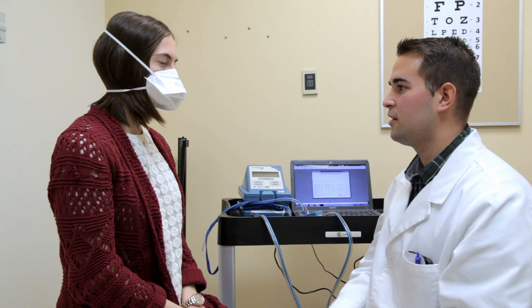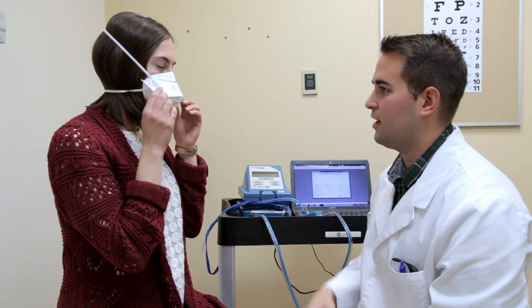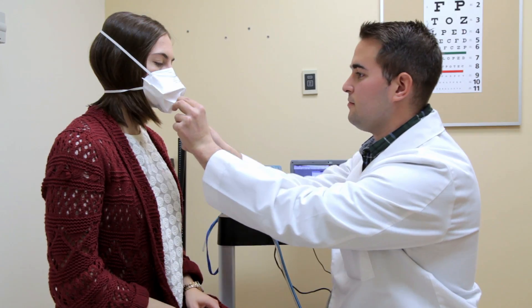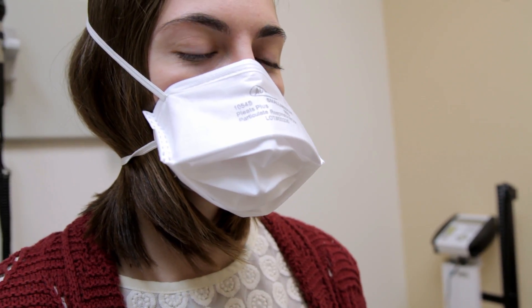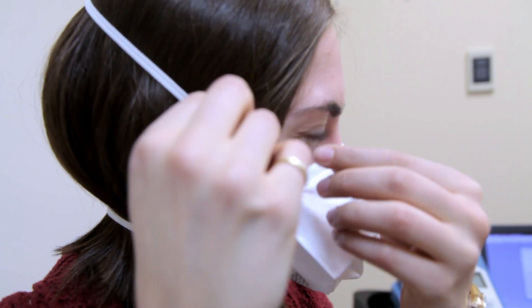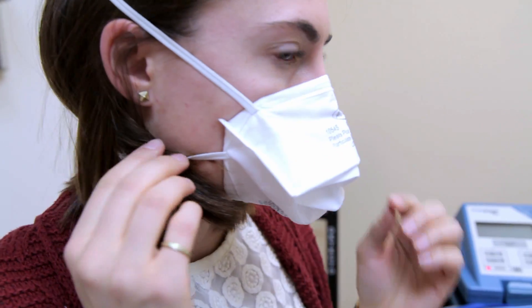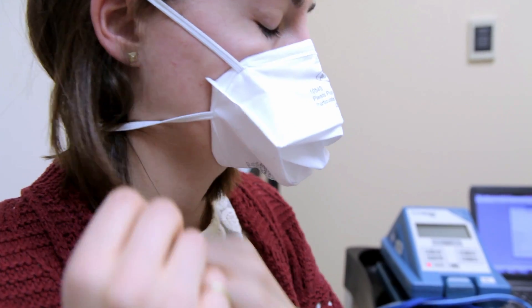At Intrinsic Analytics, our mask fit program ensures that your workers can be confident in the mask they are using. First, we ensure that the worker is able to demonstrate proper don and doff techniques. Second, we confirm that their mask fit maintains the integrity for which the mask was designed. Third, we educate the worker on the importance of maintaining mask integrity in various environments that they may experience. Finally, we ensure that they understand what conditions may warrant retesting.